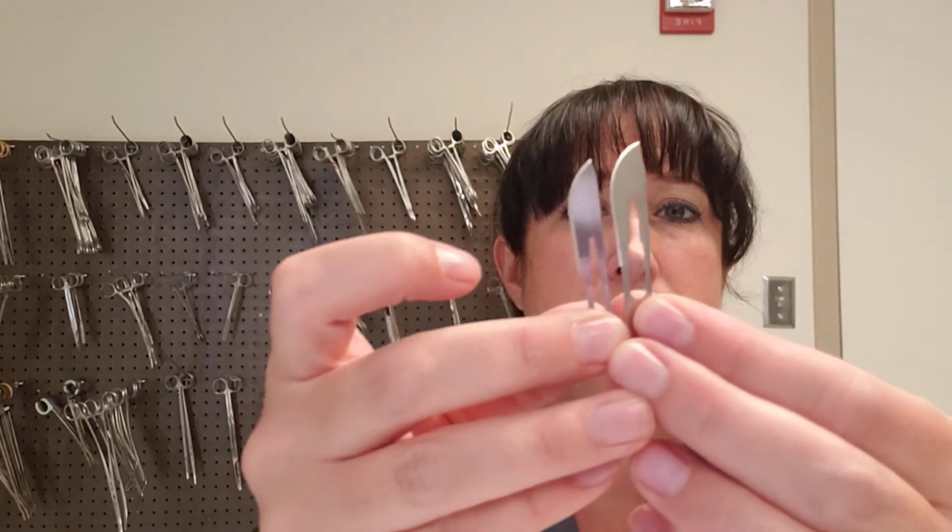This 20 and the 10 to the untrained eye may look very similar, but when you have them next to each other, you realize that the 20 is much bigger. And look how the hole is a lot bigger. That's because it's going to fit on that number 4, and it won't fit on anything else. This number 4 knife handle also comes in a long. I don't have one for the lab, but it does.